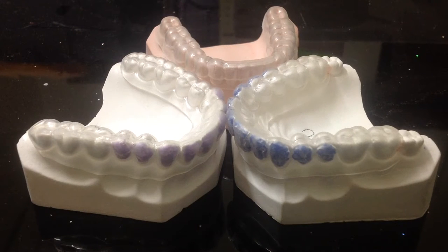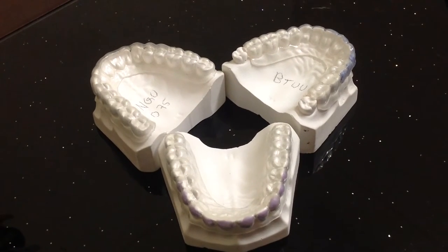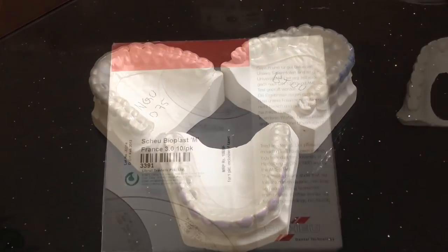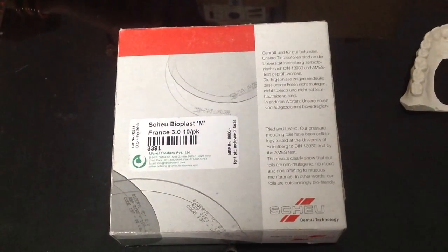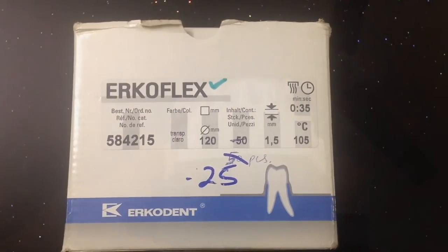I am presenting different types of bleaching trays from DA Marathon. We make mostly three different types of bleaching trays according to the spacer we use. For the foils we use either 1mm or 1.5mm thickness, Scheu Bioplast or Erkodent Erkoflex foils.